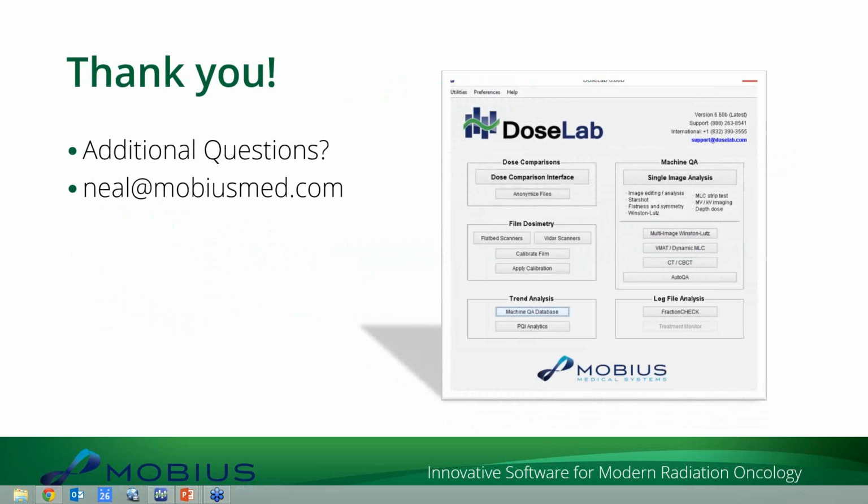So that can be done. Does the PDF report also export to the Atlas database? That I don't think so. I will double check on that for you too, James, where you keep asking me questions that I don't have all the answers to, but I will double check. But I do not believe that it exports to the Atlas database. I think it's just our database where the PDF report can be saved.